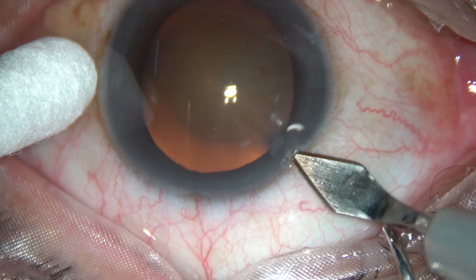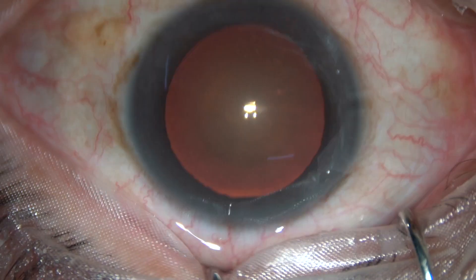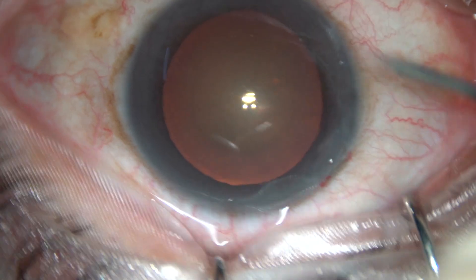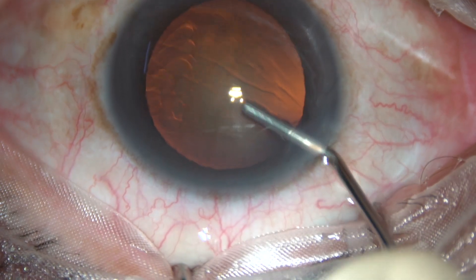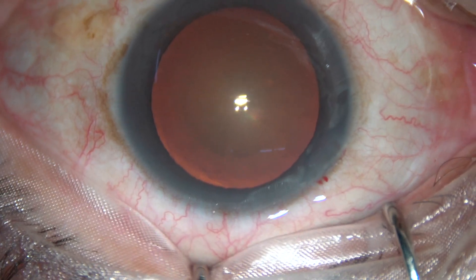Dear colleagues, in this video I intend to show a vertical chop. This is the main incision, and now a viscoelastic substance is injected into the anterior chamber. Capsulorhexis is to be done.